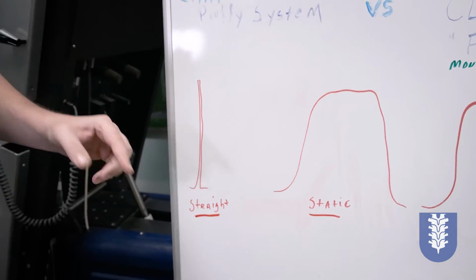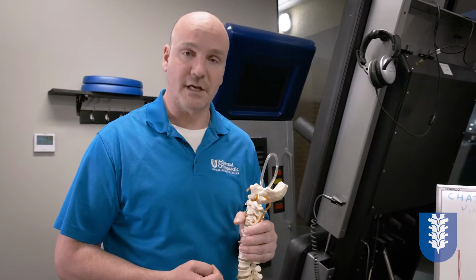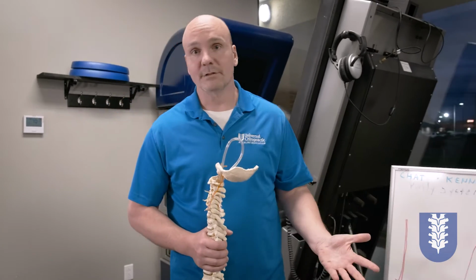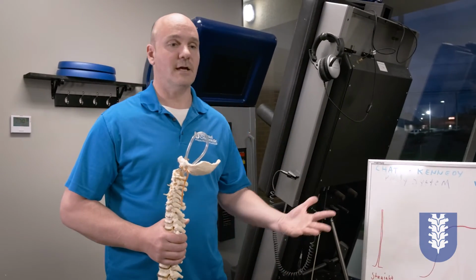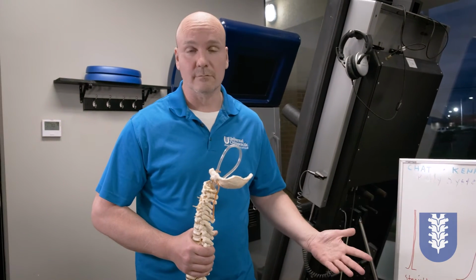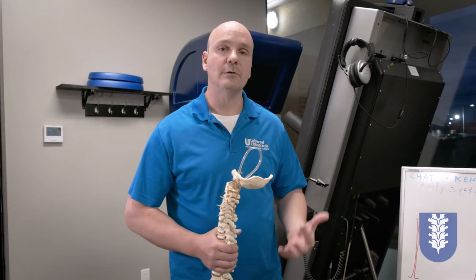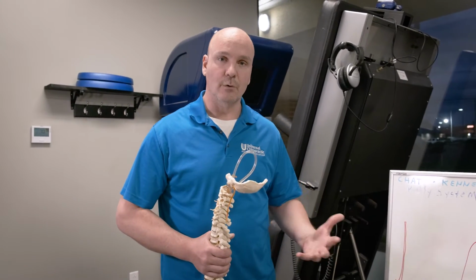and then when you're done, it releases it. The problem with that is you're going to get over contraction or overstimulation of your muscles, and it doesn't maximize the amount of disc material that can be resolved or reabsorbed with a decompression session. So inversion tables aren't bad. We tell patients all the time, if you have a back injury and you're doing spinal decompression, you want to get an inversion table and do that in between your sessions. It's great, but it's not really going to maximize disc material reabsorbing.